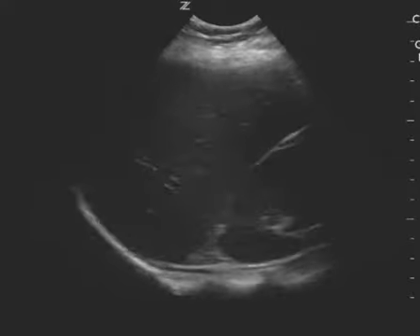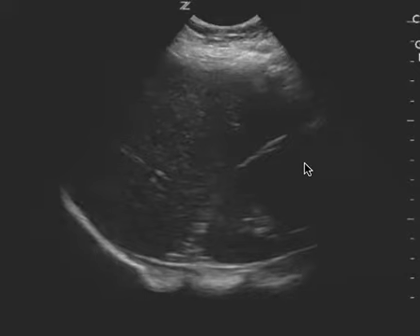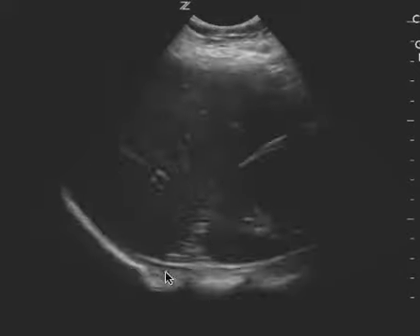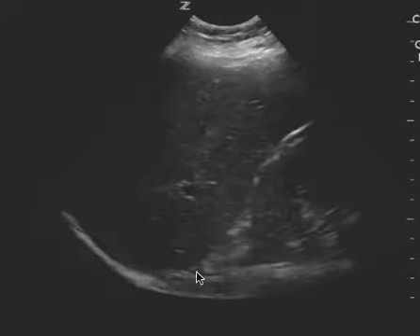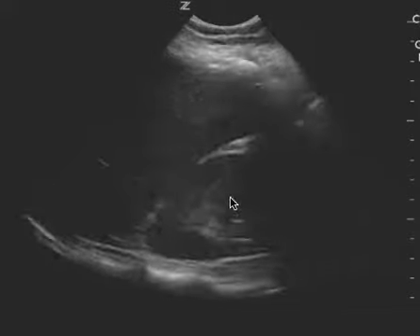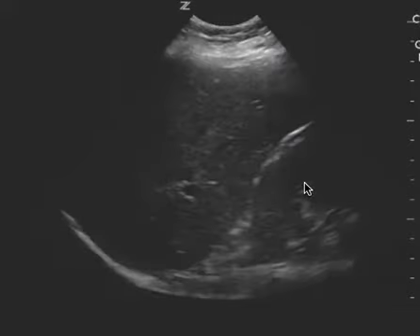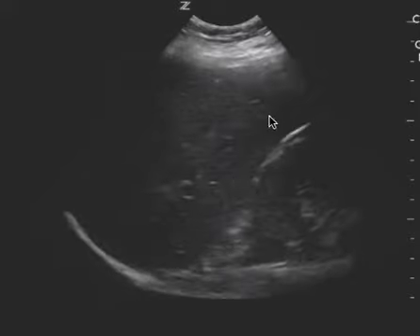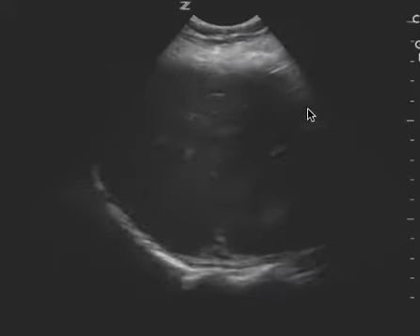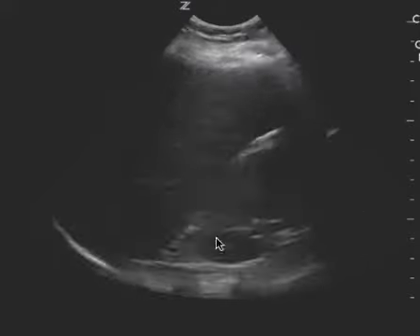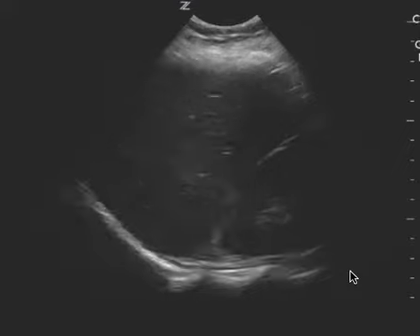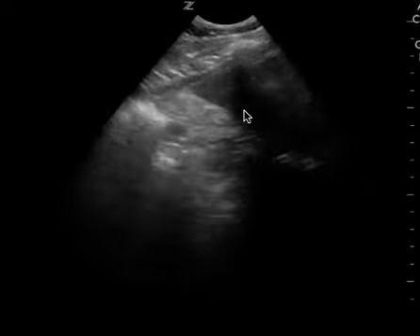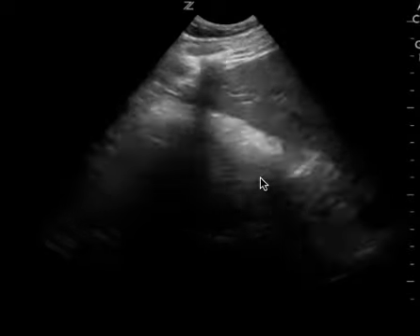This is not the patient in question, but this is an example of how you need to see the diaphragm, the spine, and the interface — Morrison's pouch — with the liver and kidney. This patient does go up to the liver tip and the inferior pole of the kidney. So this is more of what you want to see, as opposed to the area where you can't see all the anatomy together.